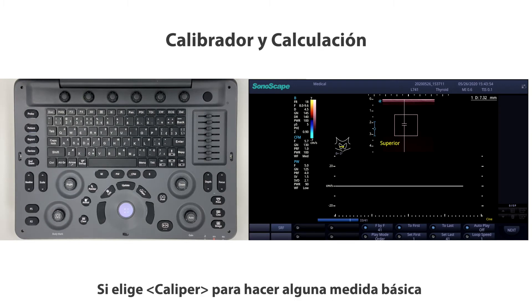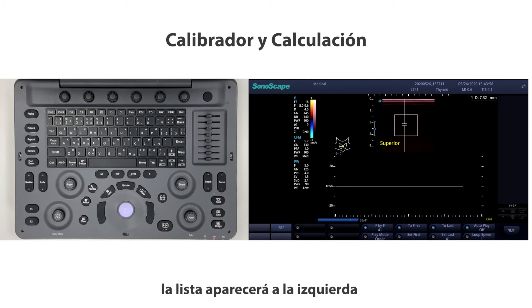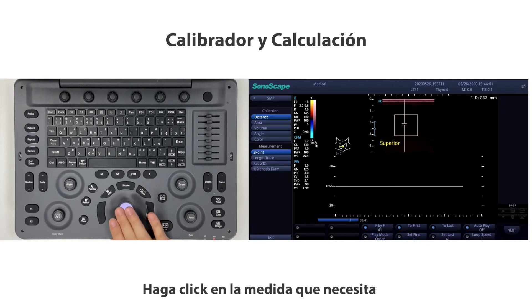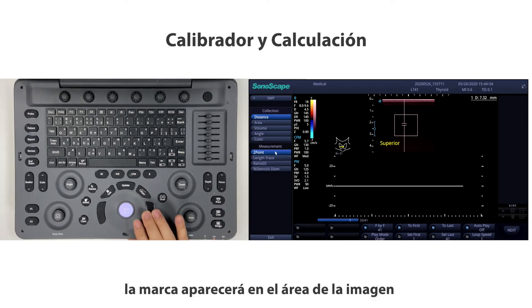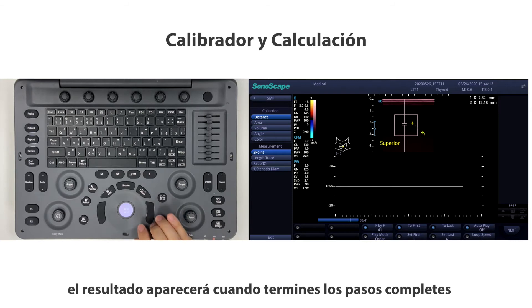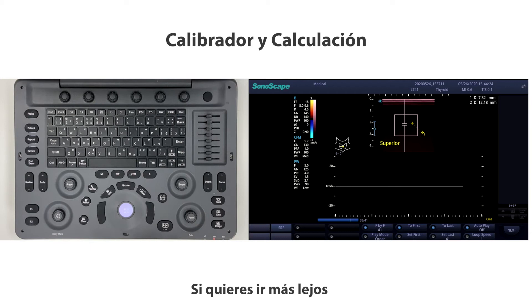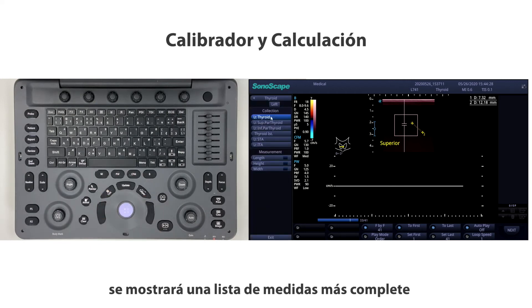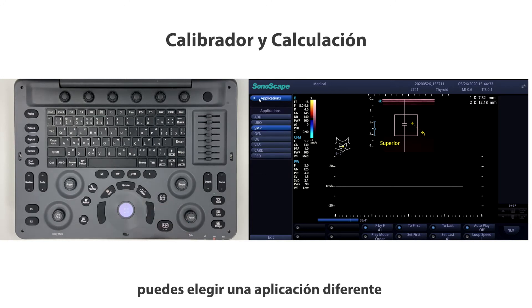For the caliper and calculation section, if you choose caliper to do basic measurements, a list will appear on the left-hand side. Click the measure you need, the mark will appear in the image area. Set the point and follow the next step by pressing SET — the result will appear when you finish. For further measurement, press the calculation button to access a more comprehensive measure list.